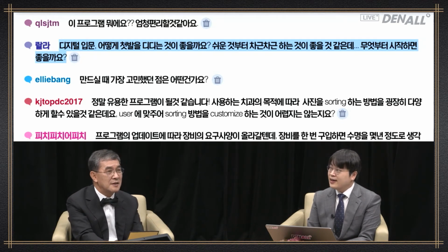If you decided to do digital dentistry, I believe people do zirconia. Doing zirconia means creating a 3D file before milling by a lab. If you can get the 3D file, get the file and make modifications if you want, and you can approach digital by working on the file.